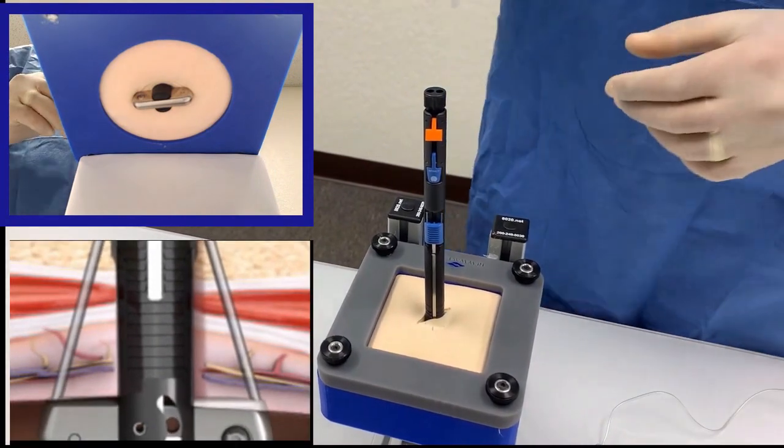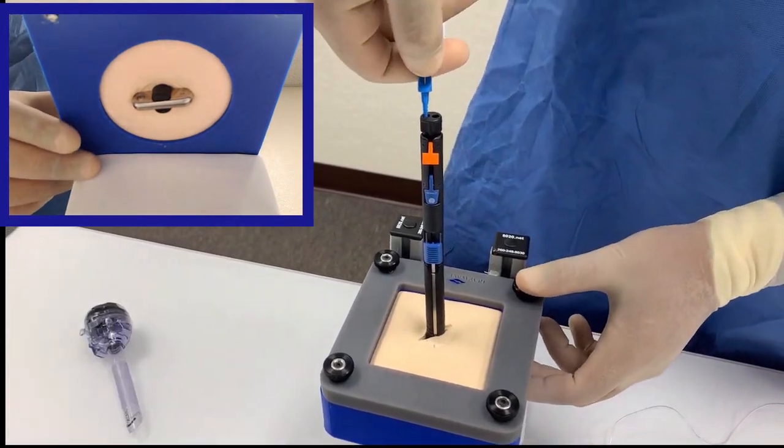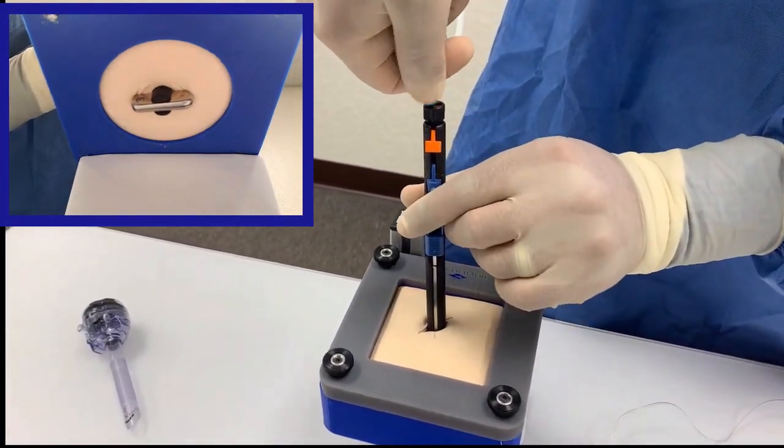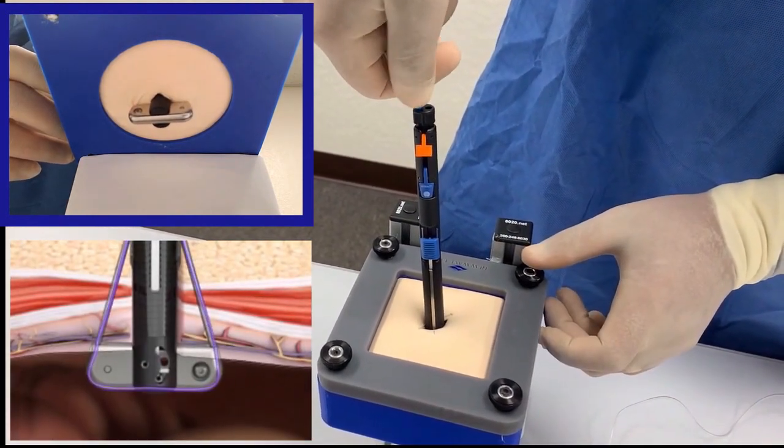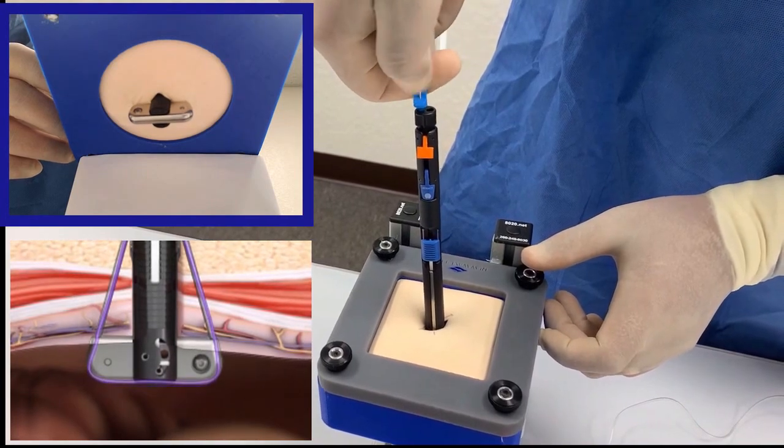Fully insert the tip of the blue guide wire advancer into either hole on top of the plunger. Using your thumb, advance the guide wire all the way until it comes out the other hole.